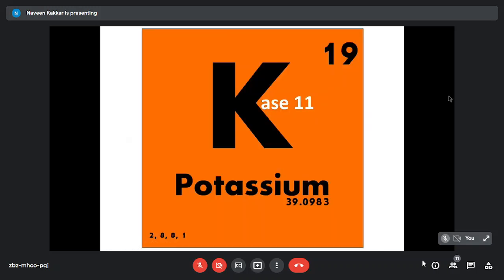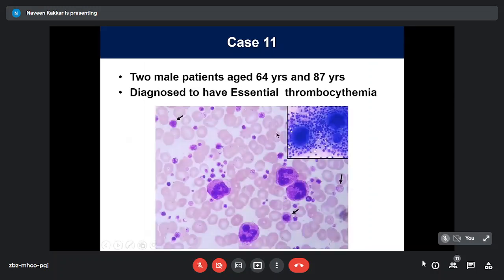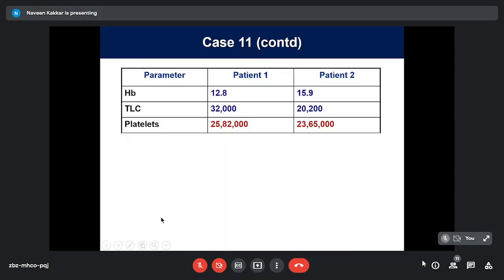So potassium. Let's look at a potassium problem now, going a bit into biochemistry. With 2 patients, elderly, diagnosed to have essential thrombocythemia, I'm showing you the smear of one of them. That's a bone marrow picture. Proliferation of megakaryocytes and marked thrombocytosis with a lot of giant platelets, huge numbers. That's its CBC parameters. TLC was high in both, and marked thrombocytosis, more than 20 lakhs in both of them.